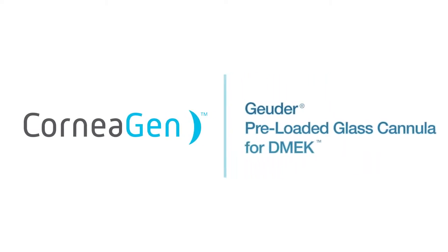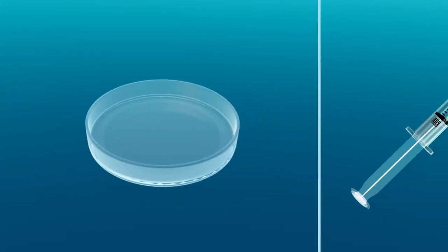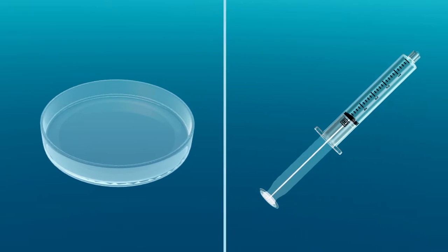Welcome to the instructional video for the Geuder preloaded glass cannula for DMEK. In addition to the preloaded cannula, you will need a sterile shallow petri dish filled with balanced salt solution BSS and one 5cc syringe filled with BSS available for use during the technique.